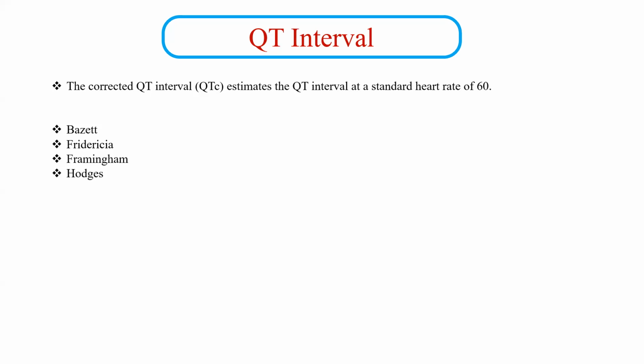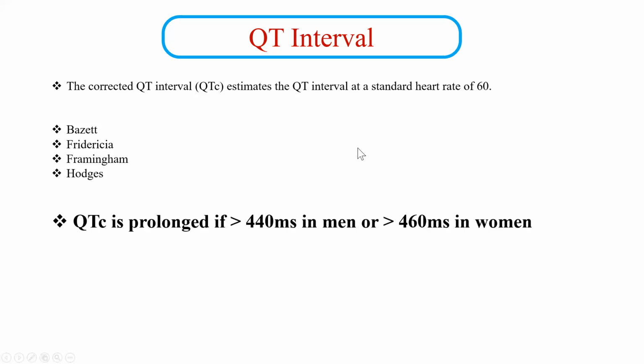Now, fortunately, guys, there are multiple phone apps and online websites that can calculate the QTc interval for you. The most useful one is actually mdcalc.com. We always use that application. You need only 2 pieces of information to calculate the QTc interval. Number 1 is the heart rate, because you are always correcting to the heart rate. And number 2 is how many small squares are in the length of the QT interval. So you just count how many small squares the QT interval is, and you enter these data into the app, and it will give you your corrected QT interval.